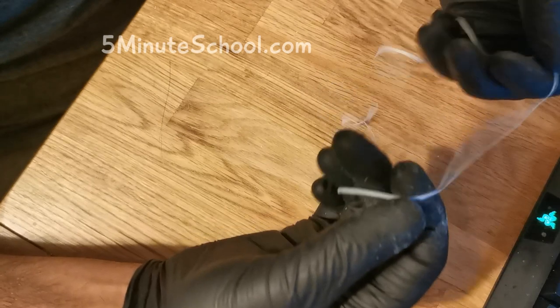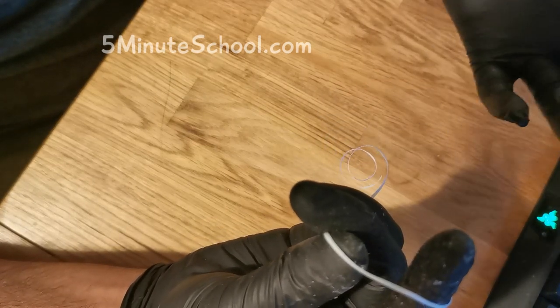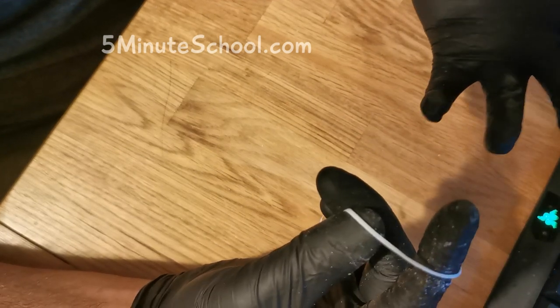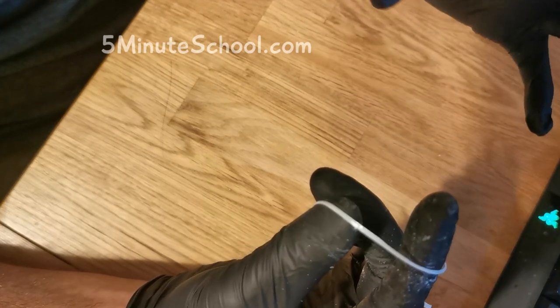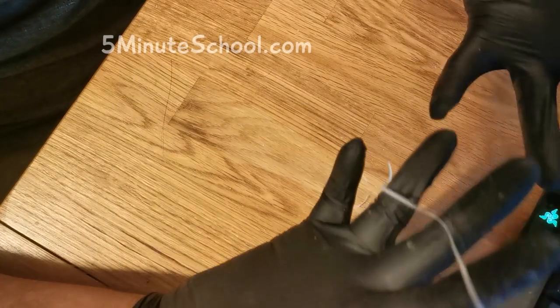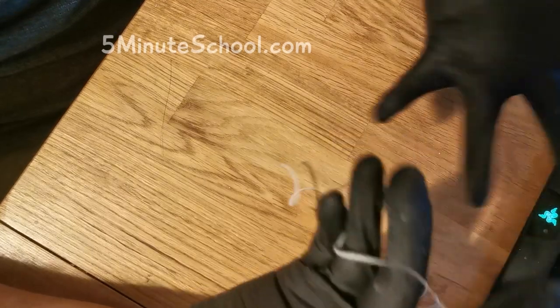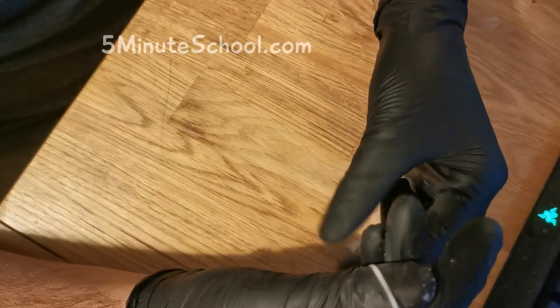So here we have our piece of floss. Now when you're tying a floss ligature and you're watching somebody do it, it looks so complicated. But I promise you once you get the hang of doing this it's very very easy, and you can probably do it with your eyes closed. I'm going to show you how it's done first at my normal pace, then I'll do another one where I slow it down and show you the individual steps.